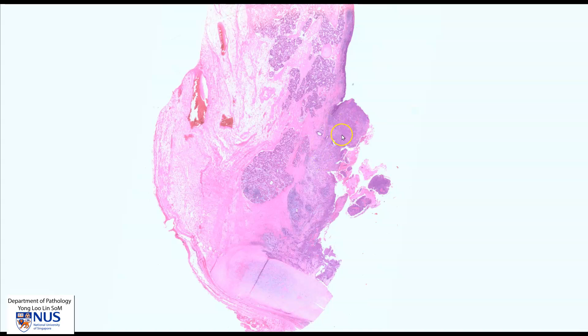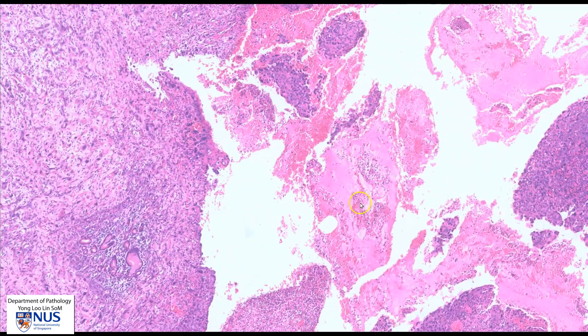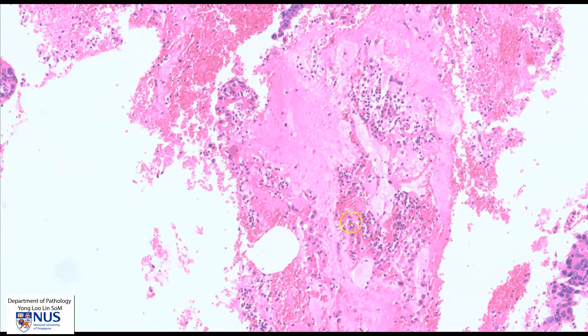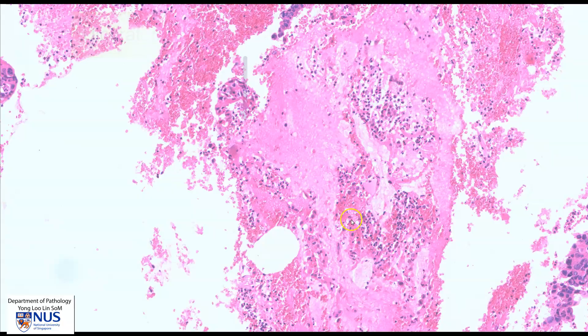Let's look more closely at the tumor, and we can see that there is a mass in this region which has areas of hemorrhage and ulceration. Here we have some fibrin due to mucosal ulceration, and this can be also causing some bleeding, and therefore the patient may have hemoptysis or the coughing of blood.